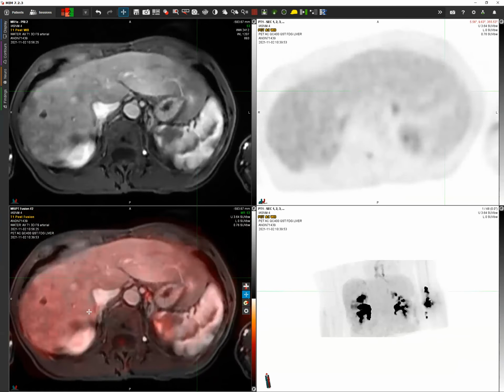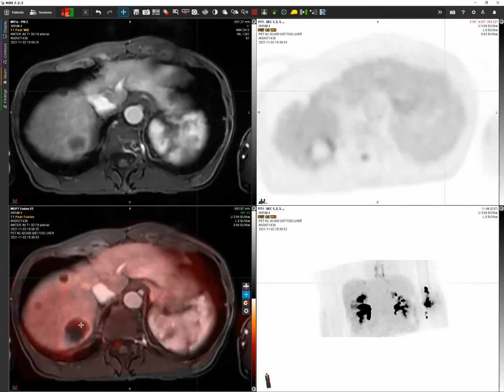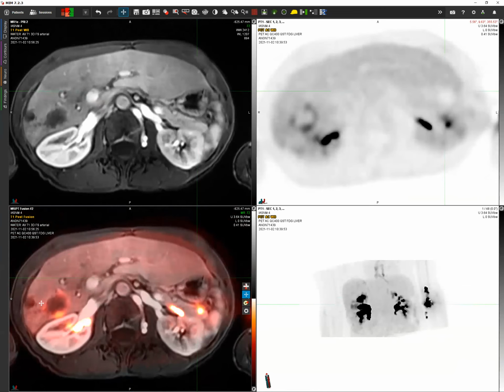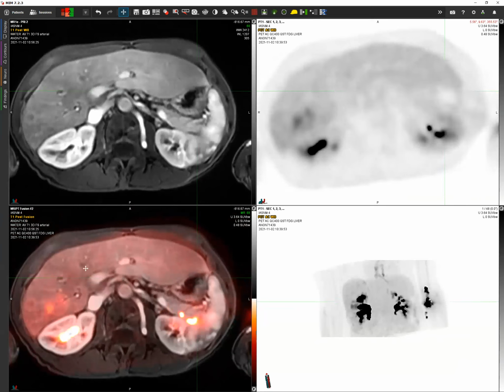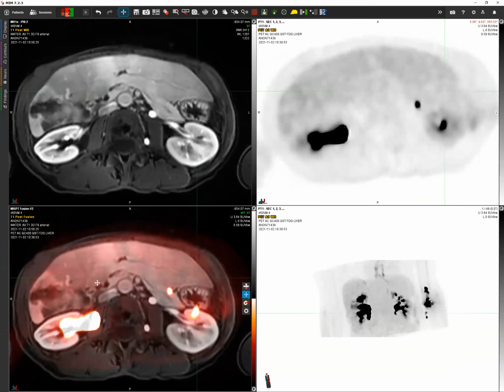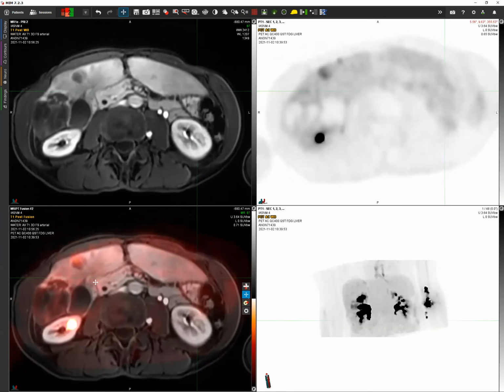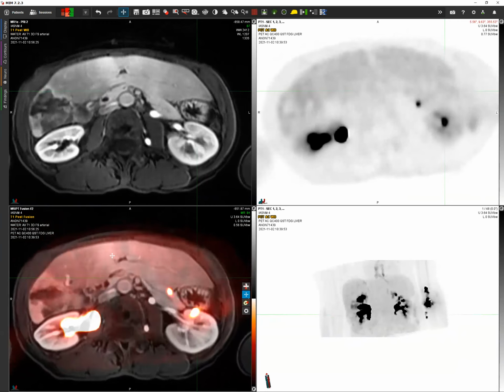So this is that lesion I showed you guys earlier, completely dead up top, then incompletely treated right here, and then new was down here. Very hard to see on the MR, very, very obvious. It's right here. If you weren't looking for it, very obvious on the PET.